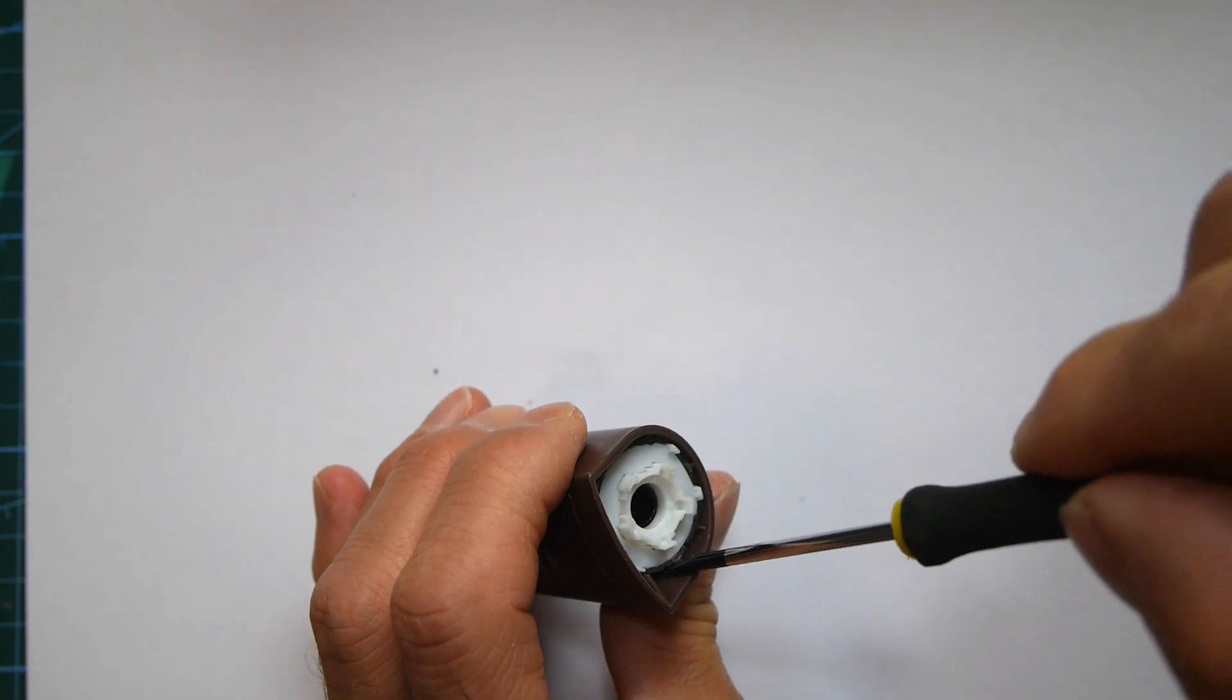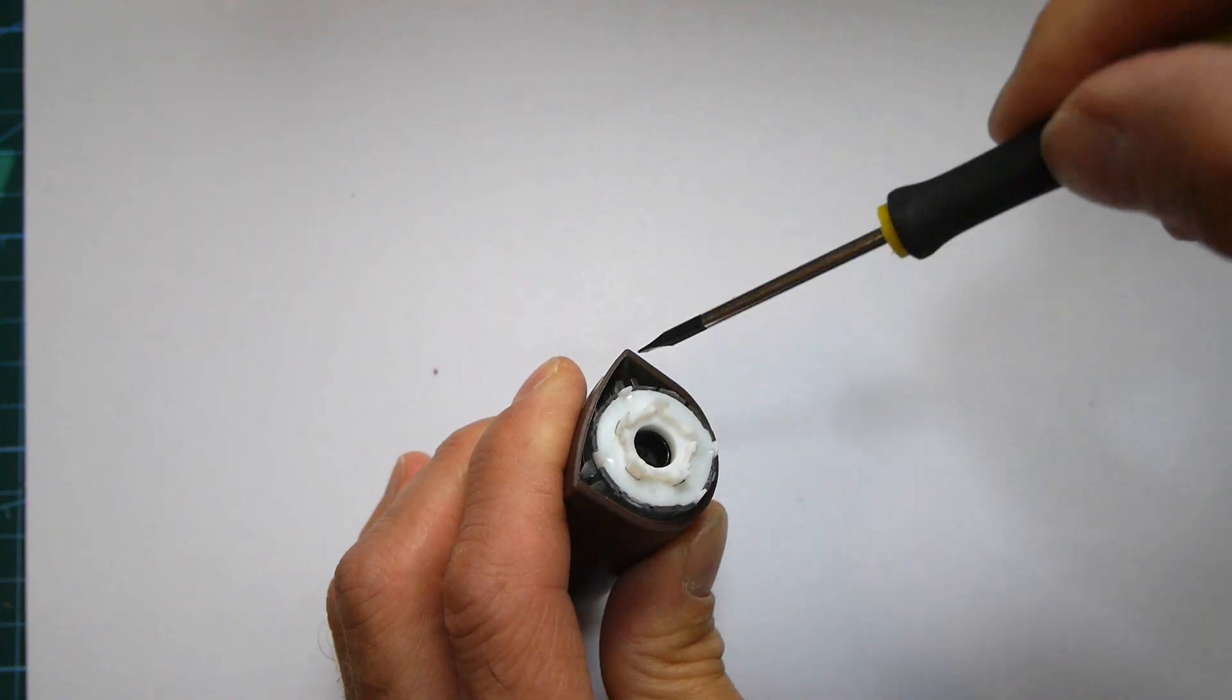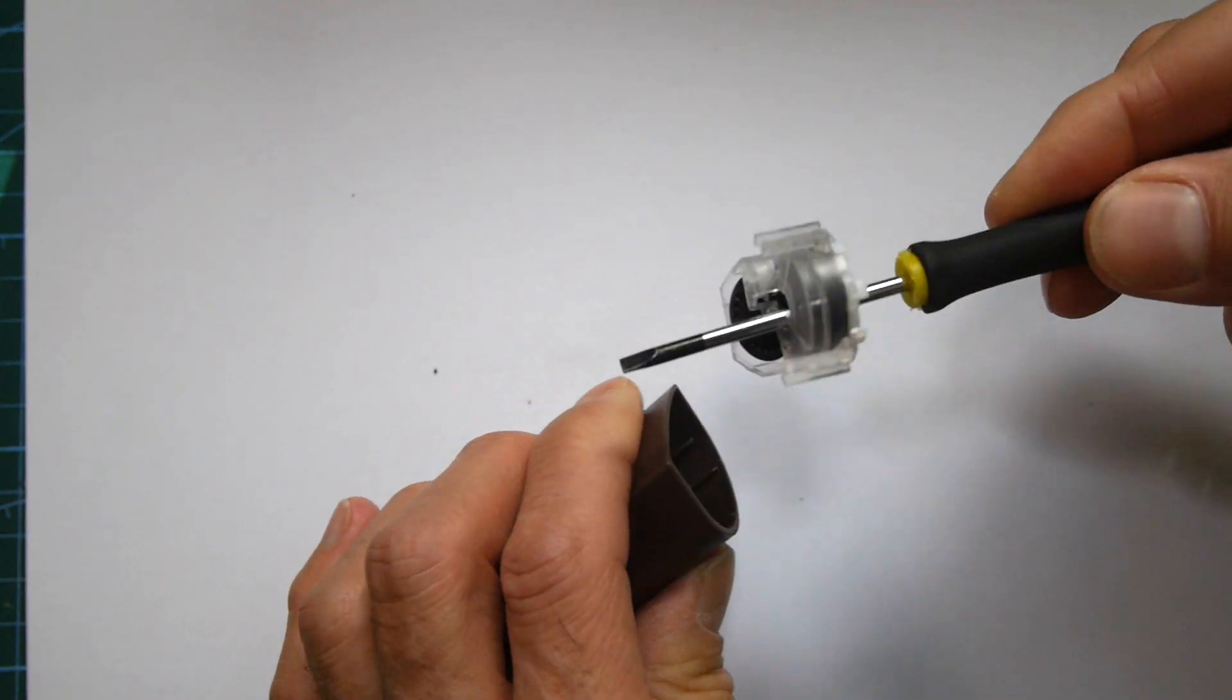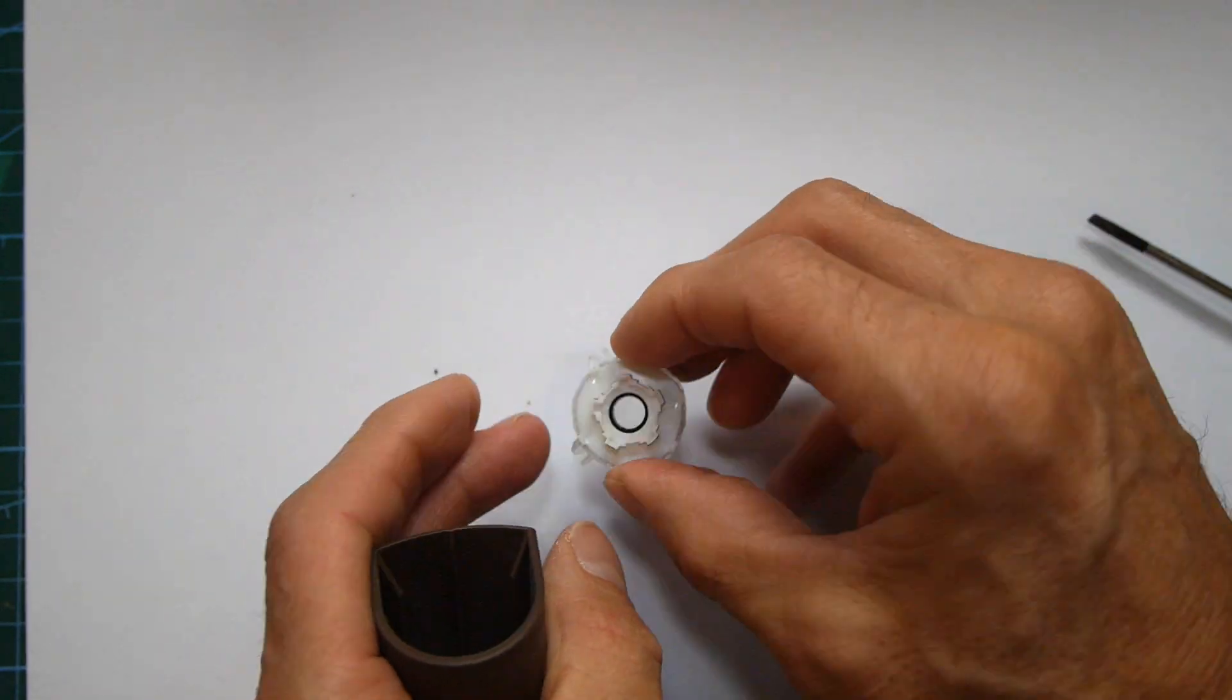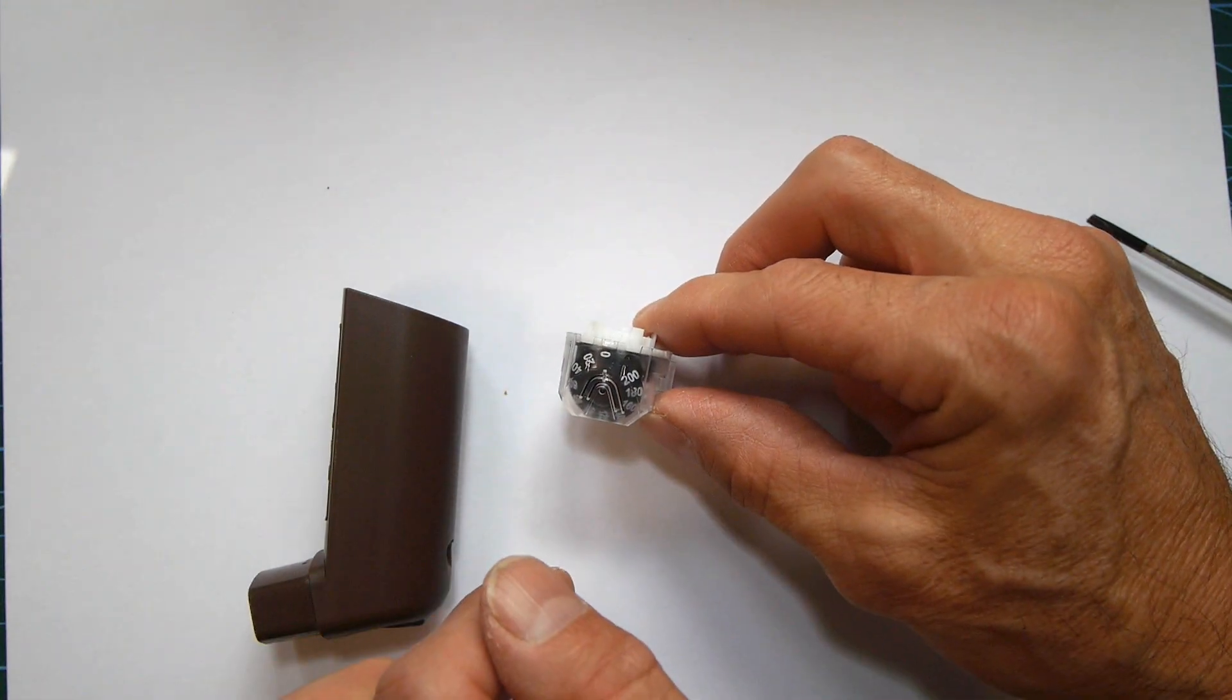Can we prise it with a screwdriver? There we go. And that's the mechanism out. So what we need to do now is take this apart and see how it actually works.